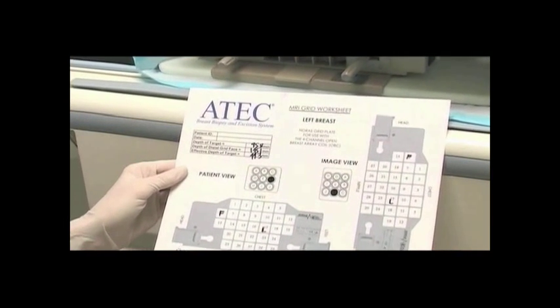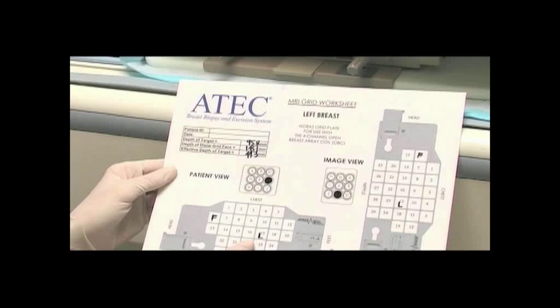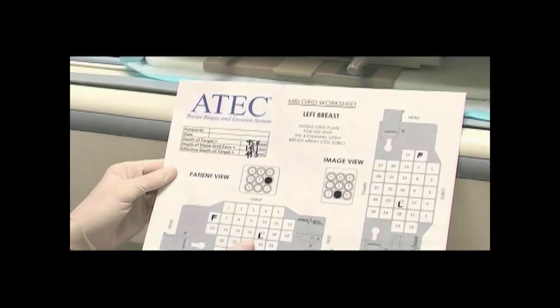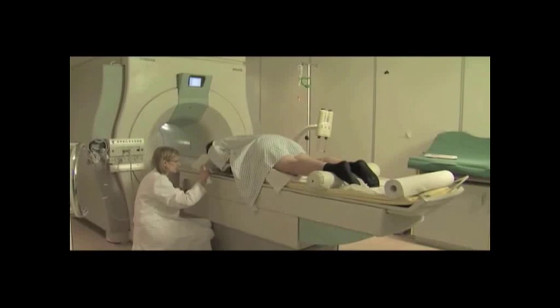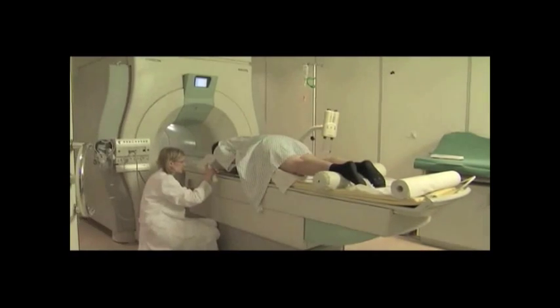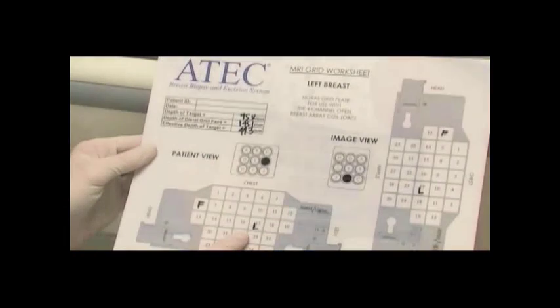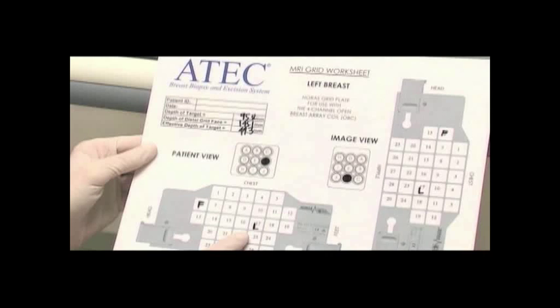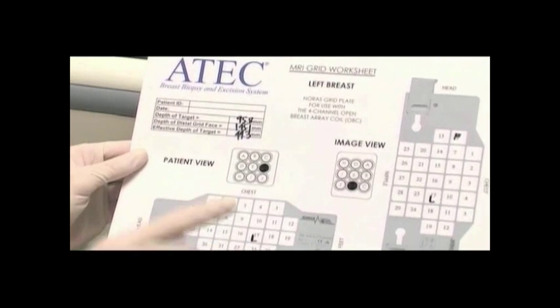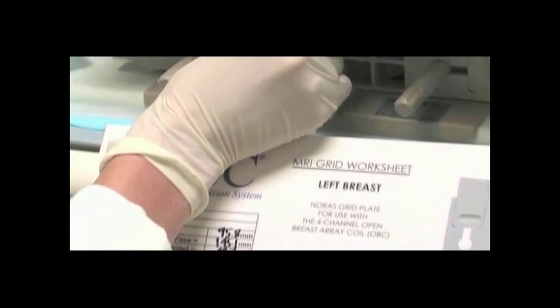With the x, y, and z coordinates calculated, you are ready to begin the biopsy process. Shuttle the patient out of the magnet. Using a sterile cleanser, swab the breast at the target biopsy site. Inject an anesthetic at the area of interest. Looking at the compressed breast in the grid, match the location marked on the grid worksheet to the actual compression grid square.